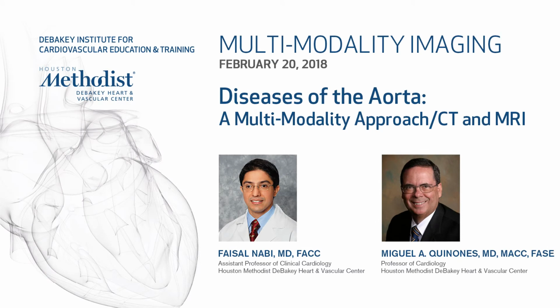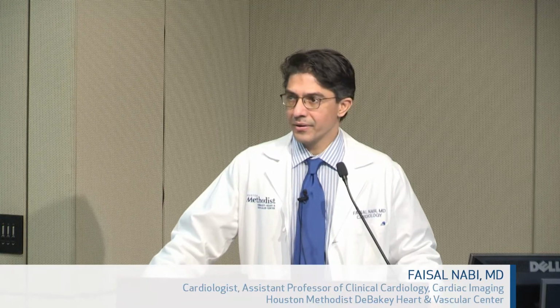We're going to be talking about aortic diseases today. I will be the lead-off hitter, followed by Dr. Quinones. I'll be covering CT and CMR, and Dr. Q will be covering echo, and then kind of a general summary of how we can evaluate patients with aortic disease. Now, I think both Dr. Q and I can attest this is a very large subject.